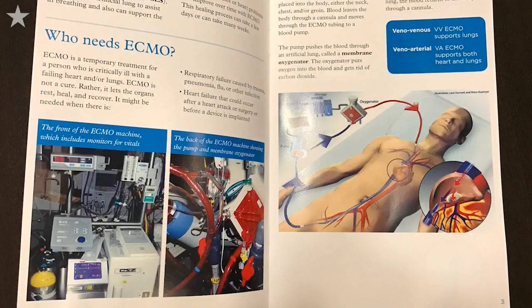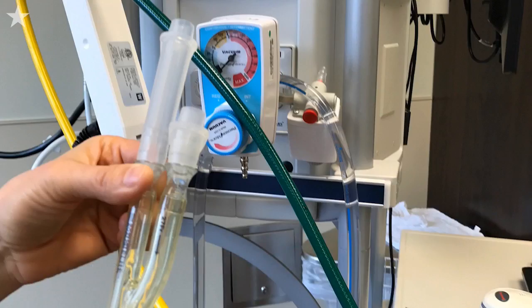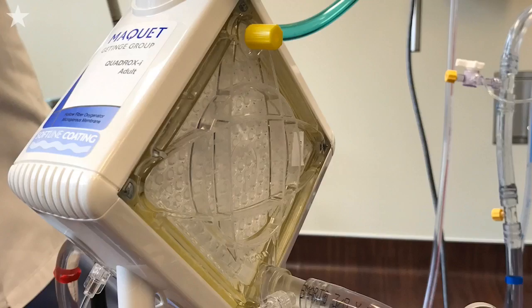This program is called the Kevin K. Nanak ECMO program. This cannula is in the body, and it's sucking venous blood, taking it out of the cannula, through the circuit, into the pump, into the oxygenator, where we're going to oxygenate the blood.